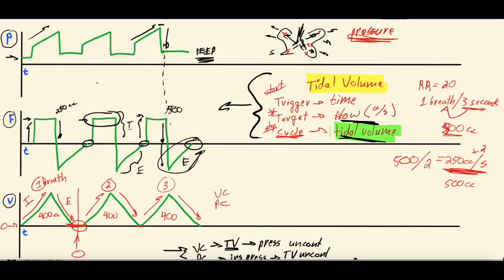And as you'll see, and we're going to link all these in the video description, when we talk about pressure control scalars, this looks different than a pressure control scalar. This ramp up is characteristic of volume control because you have a set flow rate, and as that flows over a period of time, let's just make it up, say it's 2 seconds, for every 1 second it's pushing in 250 cc's per second, or you could break this down even further into milliseconds, but it's flowing a certain volume of air in per millisecond, and that is slowly filling up the lungs, increasing the pressure until that breath is over, at which point the patient expires and the pressure goes back to the end expiratory pressure that we set on the ventilator. All right, so this is very characteristic of volume control.